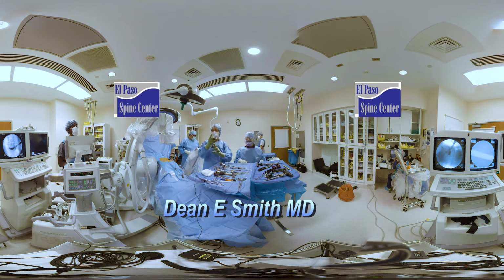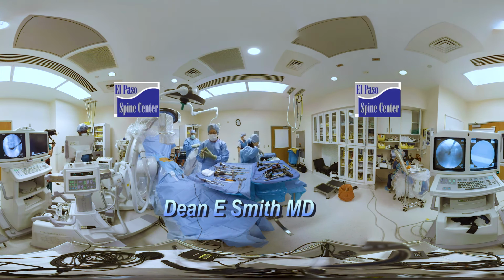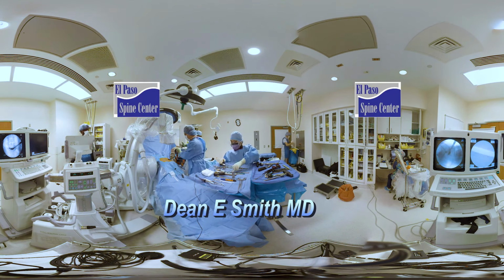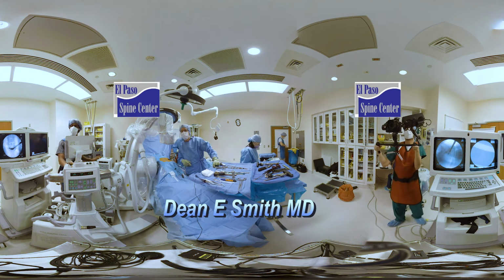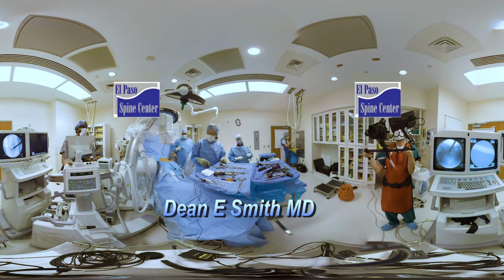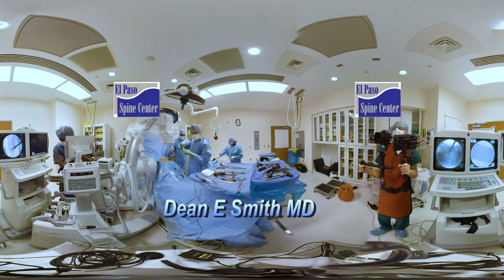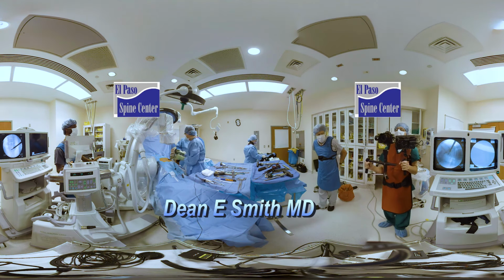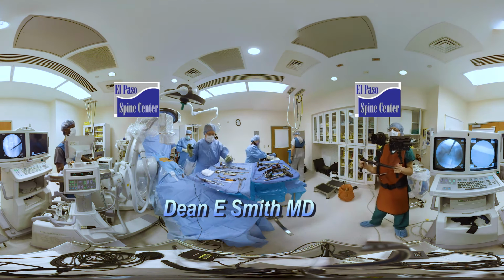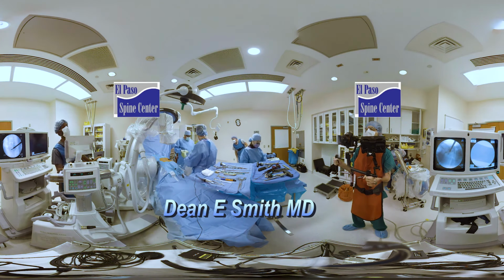Okay, so this is the balloon that we actually implant into the disc space. AP lateral, please. And that looks well positioned. Let's see, let's go down to begin with. And the plunger, am I just overlooking it? Thank you.